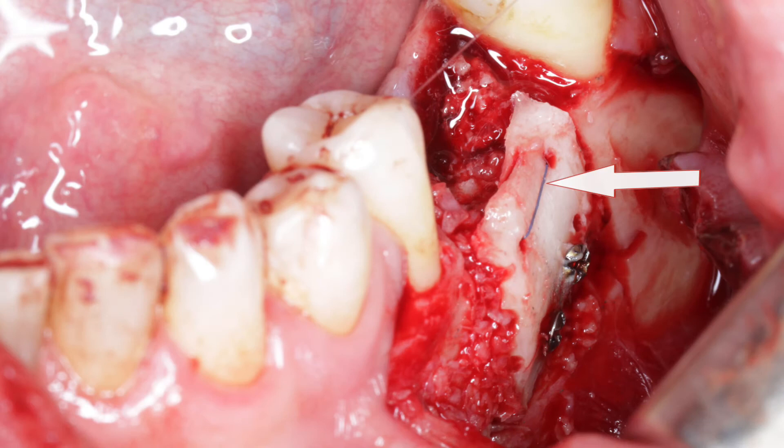Another way of fixing our bone graft is with sutures — sometimes used for membranes as well. We do a periosteum suture, going back to the periosteum on the other side. For example, in the posterior area we can suture to the periosteum, and on the palatal side we can go to the soft tissue or palate, keeping the membrane immovable with this suture.